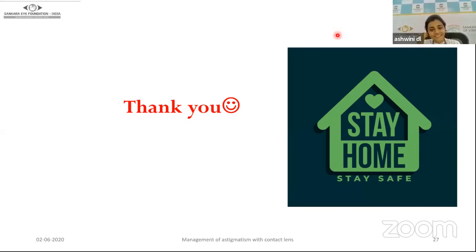Okay, sir. Ashwini, there are a couple of questions that we have. There's one question from Mr. Zaman. He's asking how much rotation is acceptable. Second, he wants to know, can over-refraction be used to detect change in axis due to rotation?